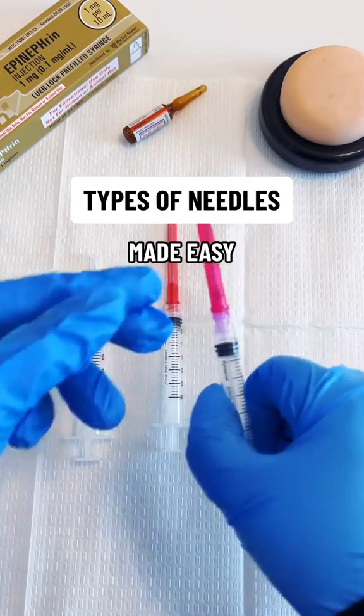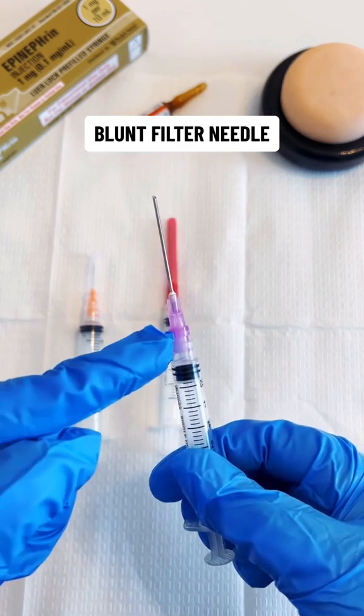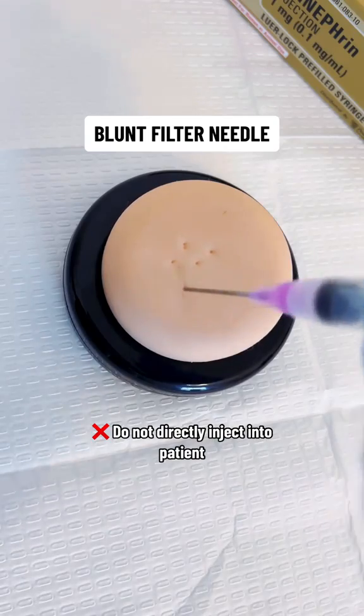Let's review the different types of needles. Starting with this blunt filter needle — it has a purple colored hub with a flat tip, or unbeveled, so you do not use this to inject directly into your patient.